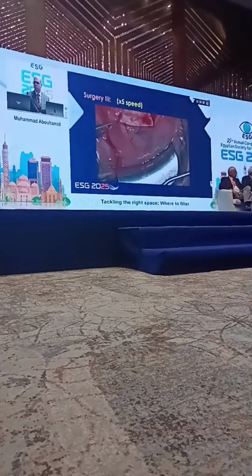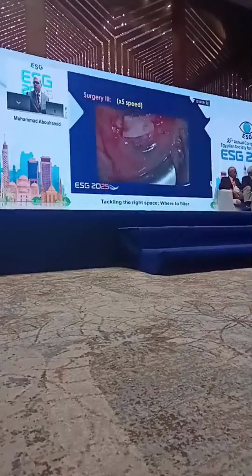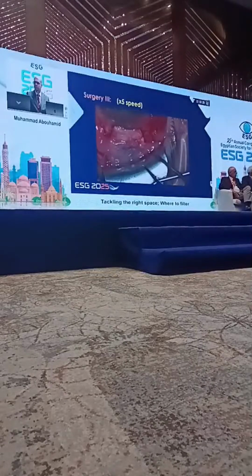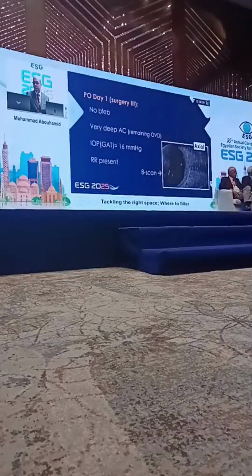And just to make sure that nothing is going here or there, we close it very tightly with overlying tight conjunctival closure. We're just exploring if anything is here or there. So the next day, there was no bleb.